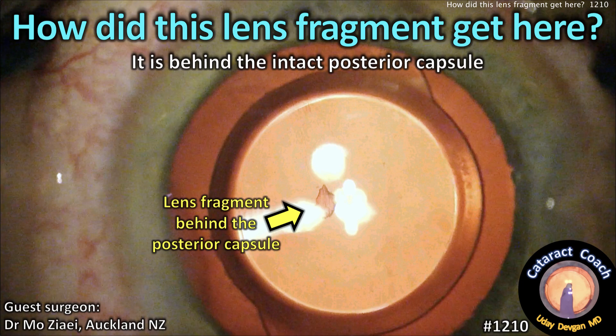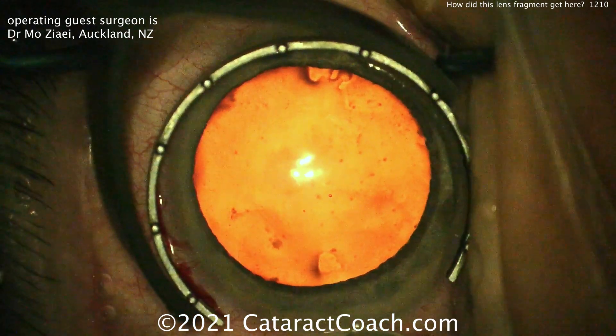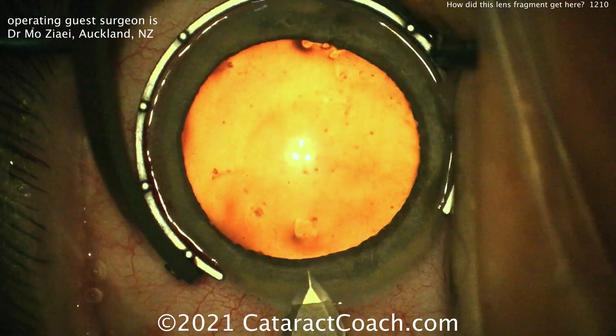CataractCoach.com. How did this lens fragment get here? It's behind the intact posterior capsule in Berger's space, in front of the anterior hyaloid face. Our operating guest surgeon here is Dr. Mo Zaieh from Alka, New Zealand.